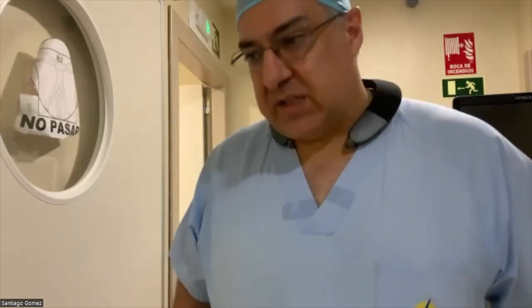I have tried all the lasers. I appreciate the nearly perfect hemostasis from thulium fiber and post thulium lasers, but I still would stick with holmium for the majority of cases. If you ask me what is your favorite, I would go for holmium too.